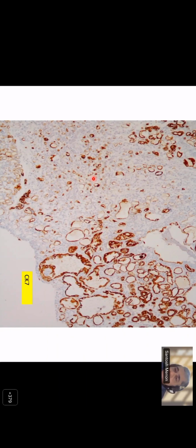It was my differential diagnosis, sir. It was my DD, but it was not my final diagnosis. I couldn't make that. Yes, that's fine. So you have to keep that in differential. So it does look like a signet ring, so you have to think that.